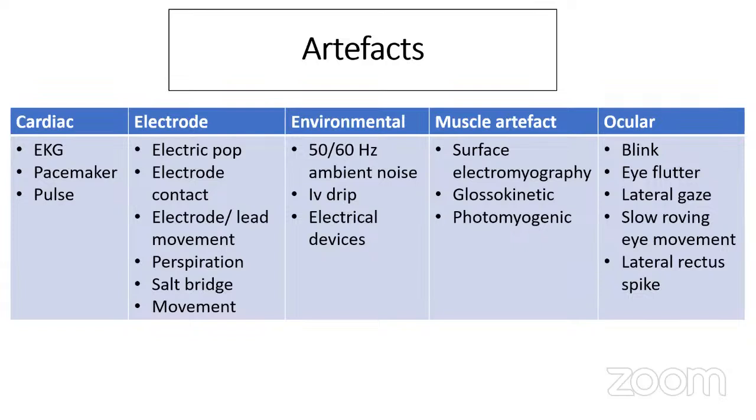There can be hundreds of sources of artifacts. The best way to identify an artifact is if you have a simultaneous video where you can see exactly what is happening to the patient at that time or in the environment.